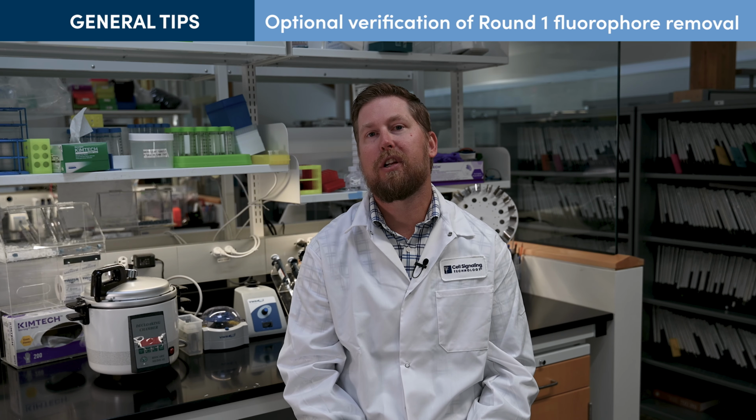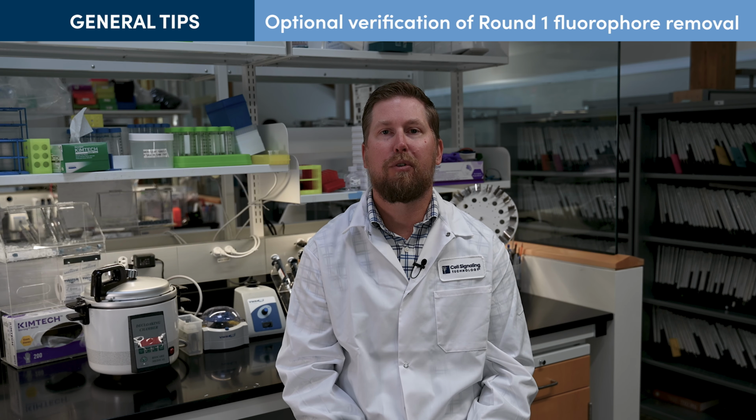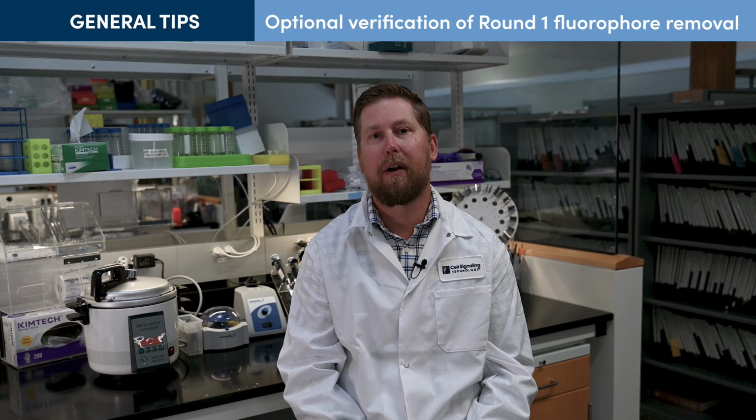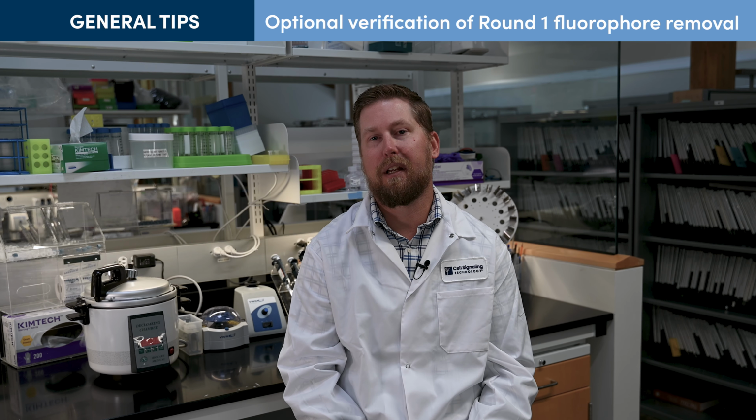As an optional quality control step, samples can be imaged after the fluorescence removal step. This can be used to verify complete removal of fluorophores from round 1. As long as the kit is used before its expiration date, we have found this control is not required, but it can give you extra peace of mind in the accuracy of your multiplex dataset.